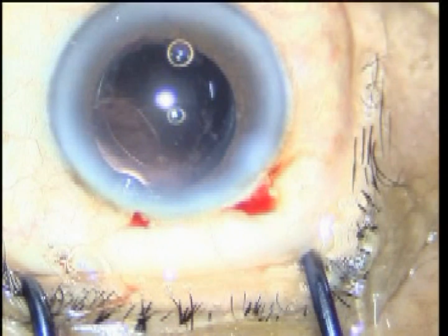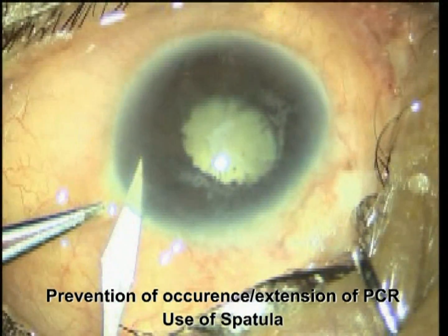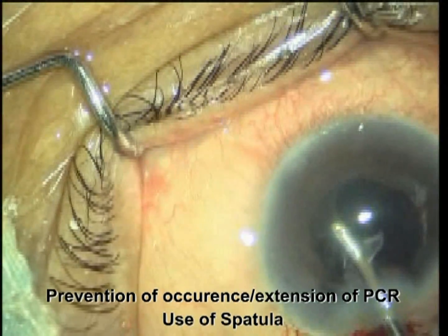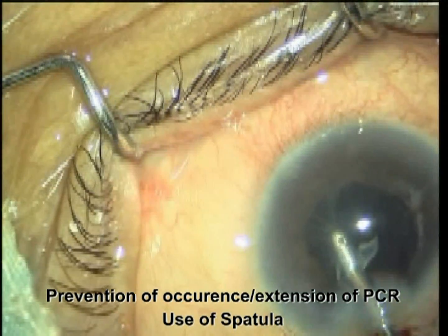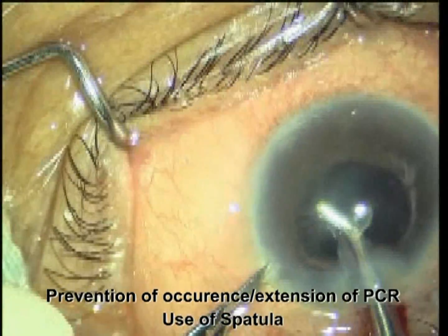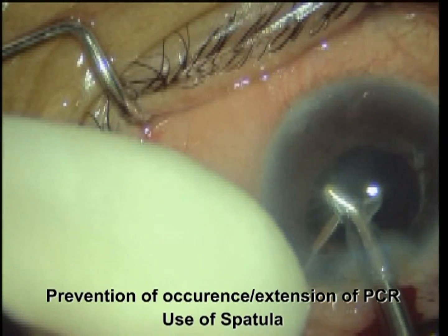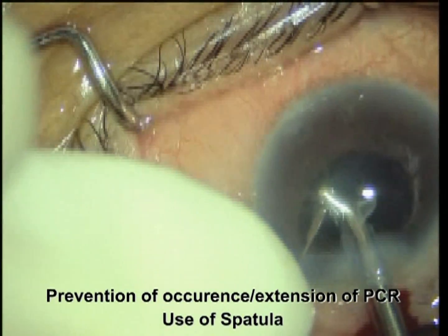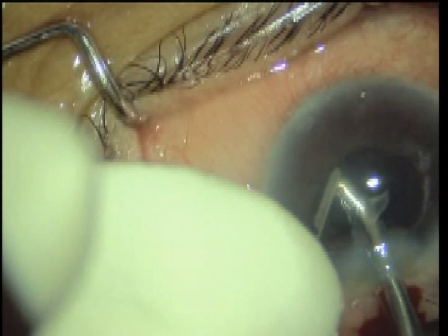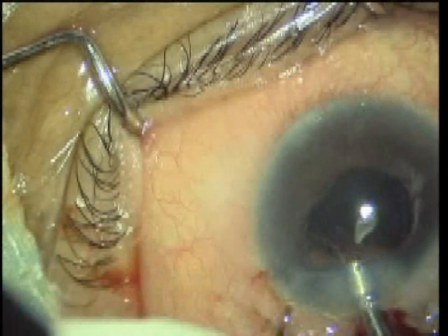Here we can see a well-defined rent. Another way to prevent the occurrence or extension of PCR is using a spatula. Once you catch hold of the posterior capsule and reflux is not releasing it, then through the side port use an iris spatula or iris repositor-type instrument and release the caught posterior capsule from the probe.